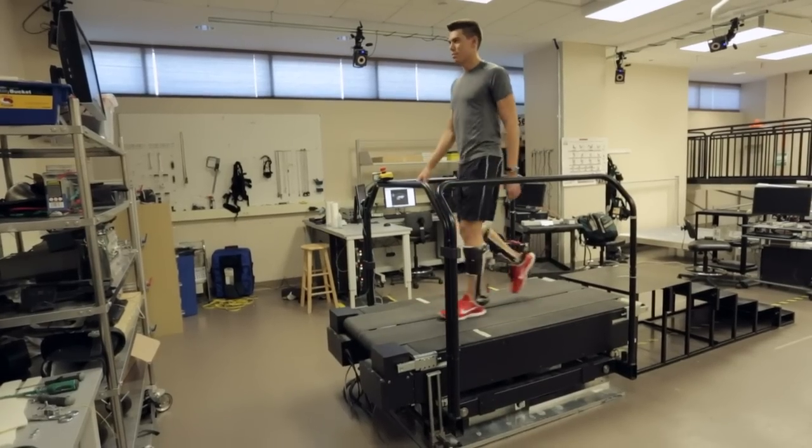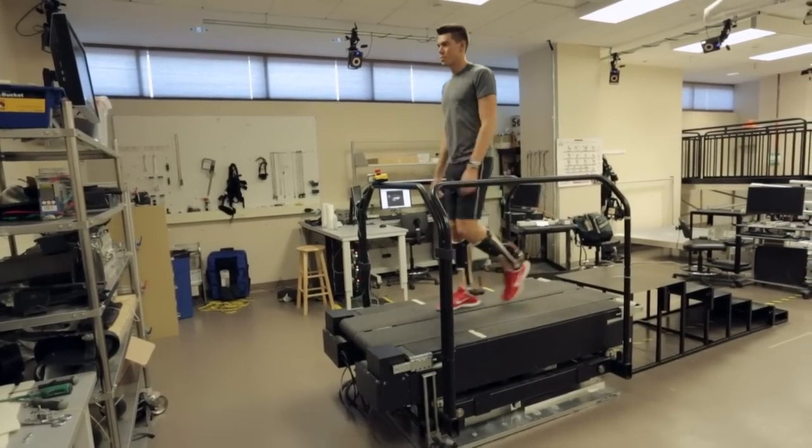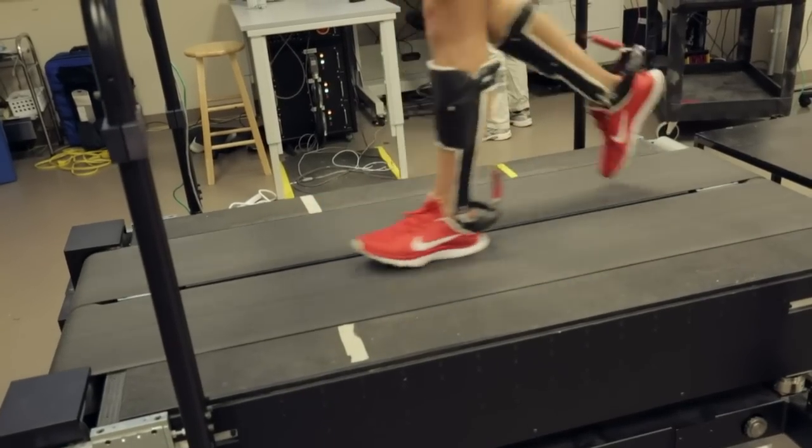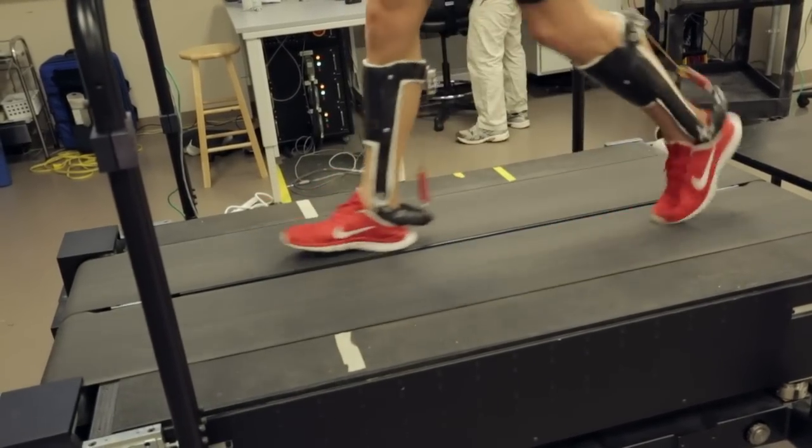What we learned in our lab over the last few years is that humans, when they use their calf and Achilles tendon, they're not using their muscles as motors — they're actually using their muscles as clutches.